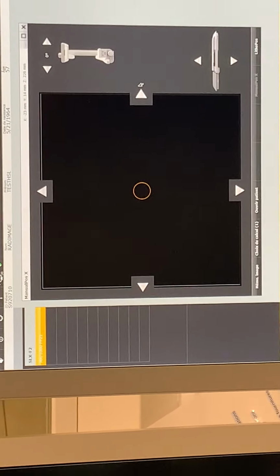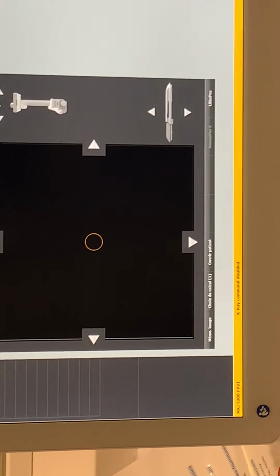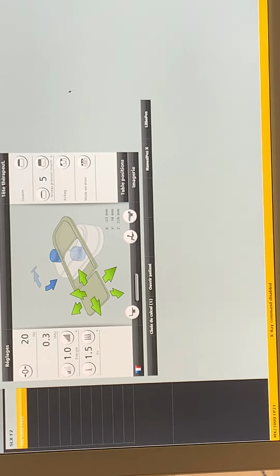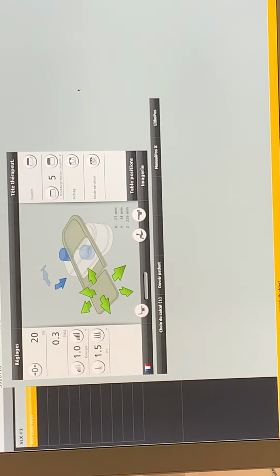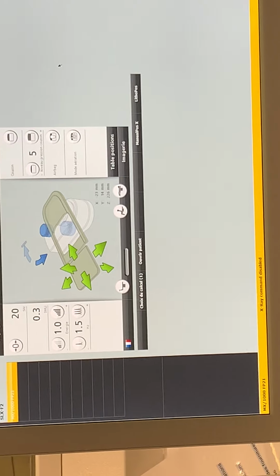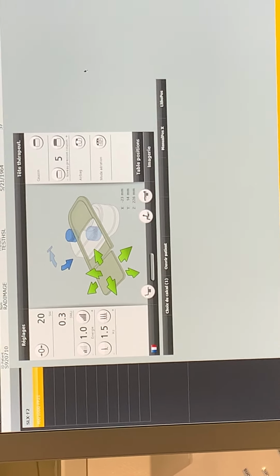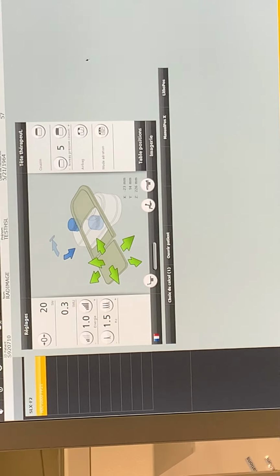That's why it is much more important to have the stone in X and Y aligned. Okay? Good. The stone is in the middle, and now you need to ask yourself the three questions before you start the treatment. Is the stone aligned in X, Y, and Z? Do you have water between the patient and the patient foil? And do you have silicone oil on the therapy head? If you can answer these three questions with a yes, you can start with the treatment.